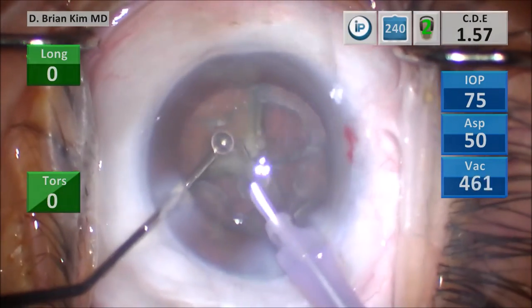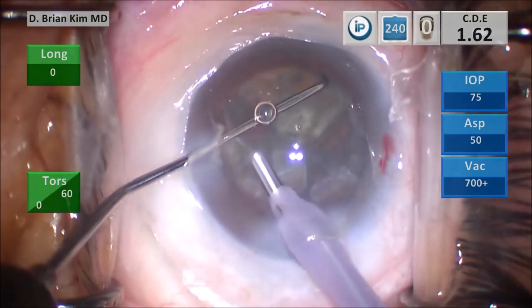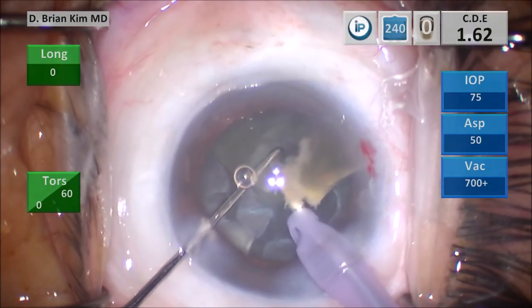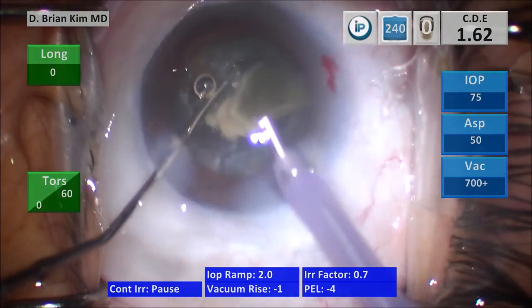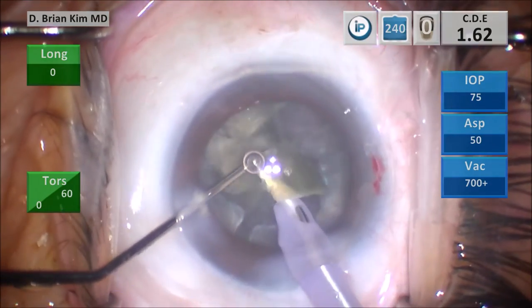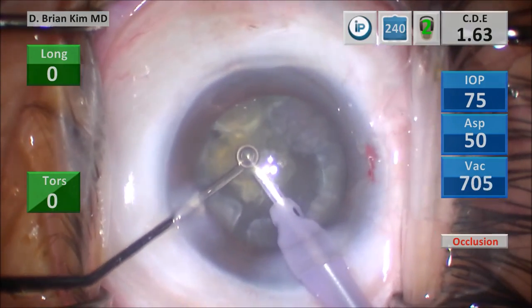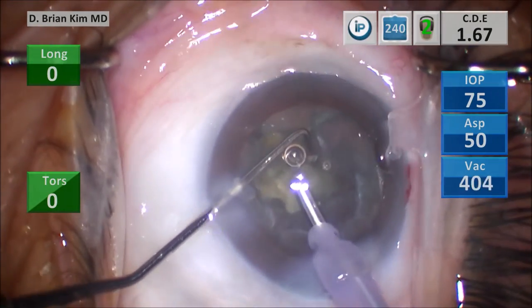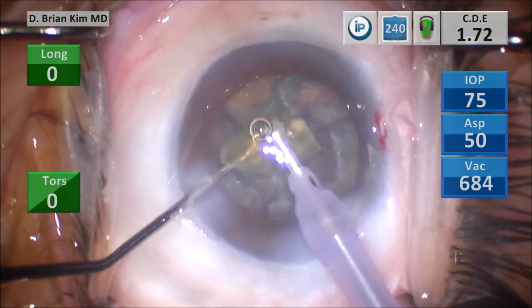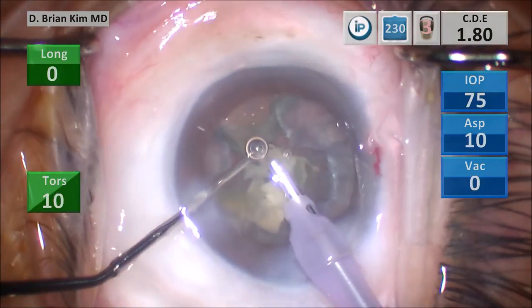Now this is the final quadrant. I'm going to place the chopper out to the equator going underneath the epinuclear ridge. I'm pulling the chopper centrally; the phaco tip is in a deeper position. It crushes the girth of the lens piece and it's completely bisected. I'm going after another piece, crushing the lens piece between the chopper and the phaco tip using mechanical fracturing forces and high vacuum to emulsify, then using bursts of ultrasonic energy as needed to remove the lens pieces.